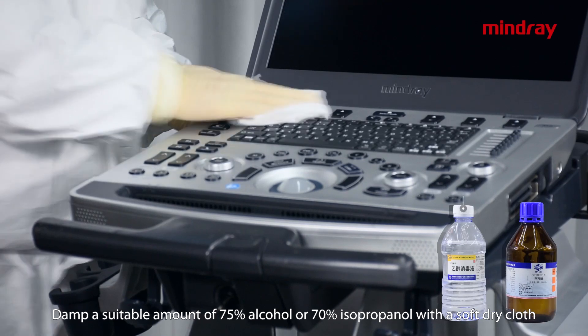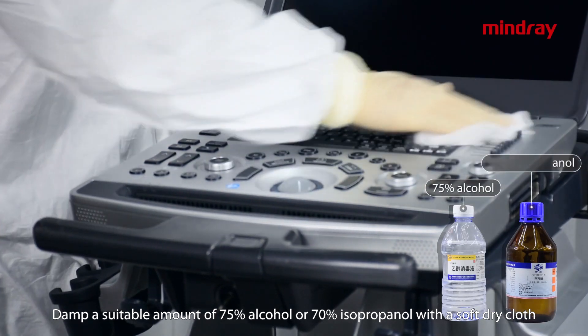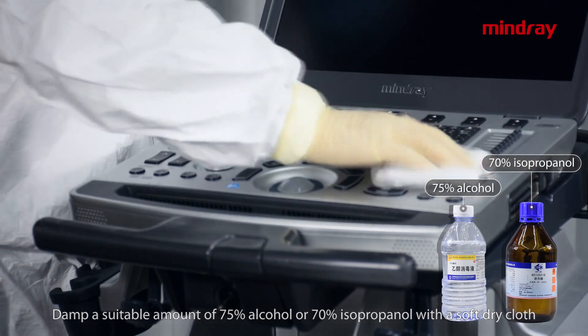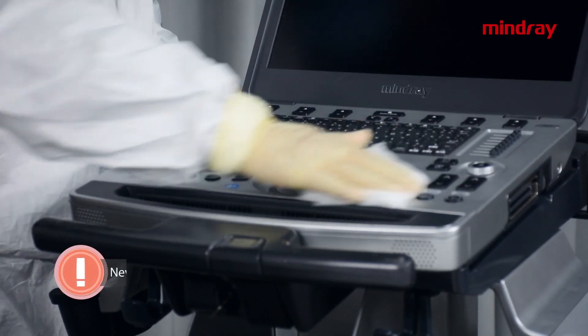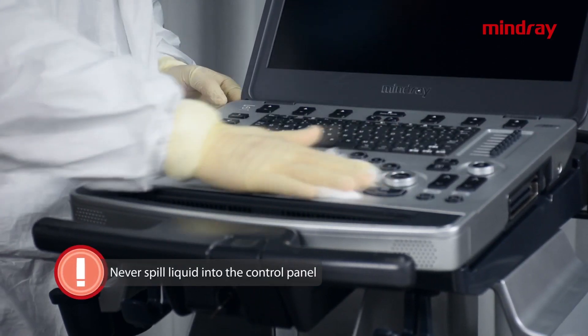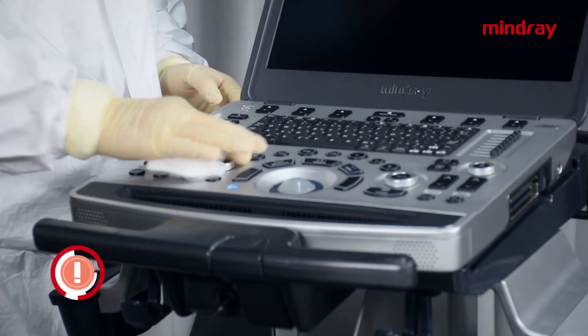Control panel disinfection: dampen a soft dry cloth with a suitable amount of 75% alcohol or 70% isopropanol and wipe the control panel for disinfection. Caution: never spill liquid into the control panel. After wiping, dry with a soft dry cloth or air dry. Never dry the control panel by heating.